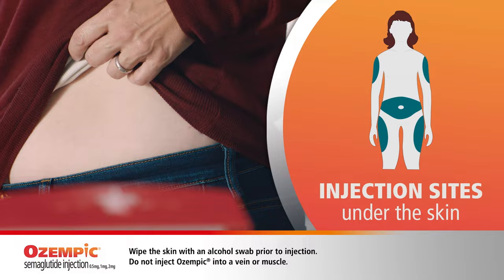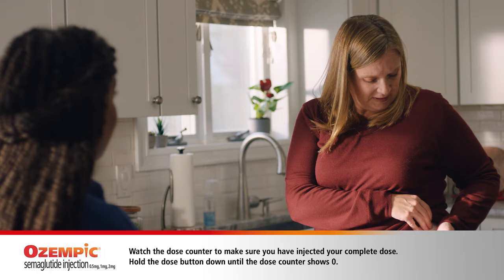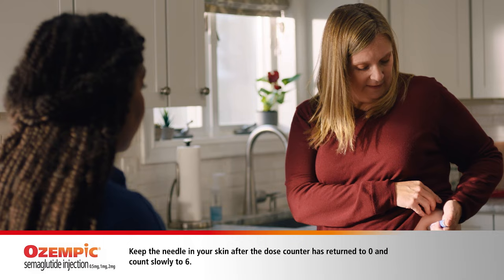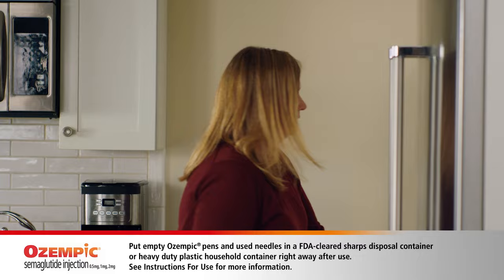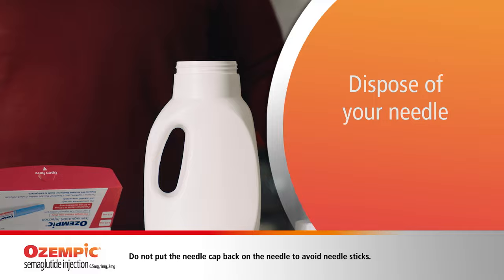Are you nervous about the needle at all? Maybe I was in the beginning, but it's just become part of my routine. Look how thin this needle is. So, it's time to inject. I'm just gonna make sure I can see the dose counter first, and then insert the needle into the skin. Press and hold the dose button until the dose counter shows zero. One, two, three, four, five, six. I just gotta carefully remove the needle and dispose it. You can buy a sharps container or use a hard plastic bottle to throw away needles.